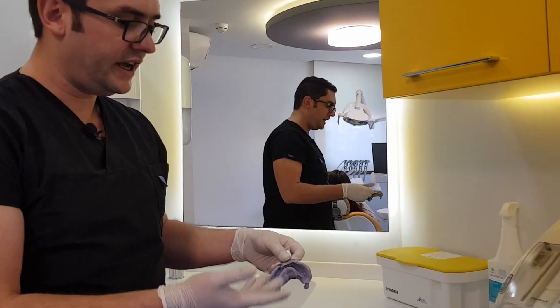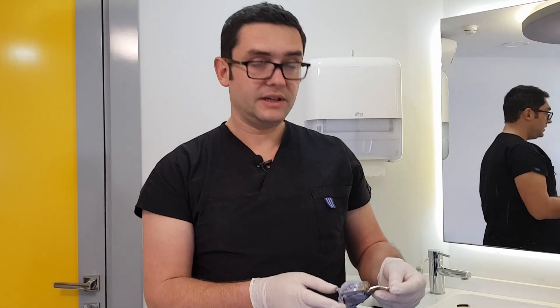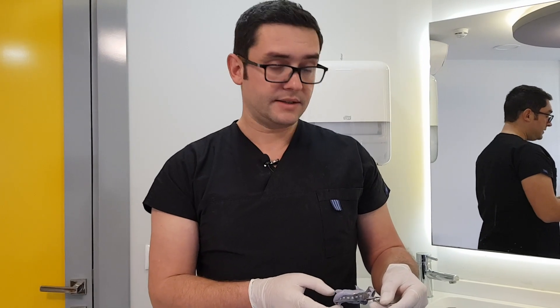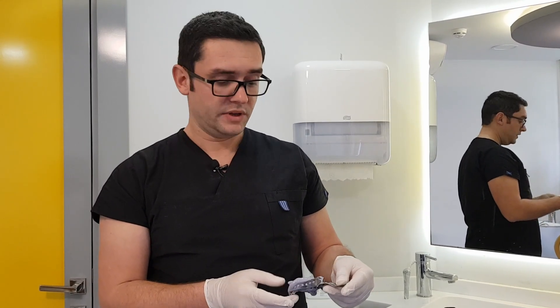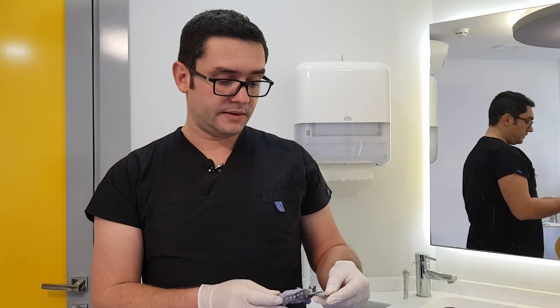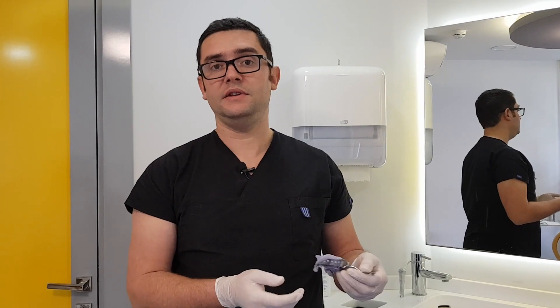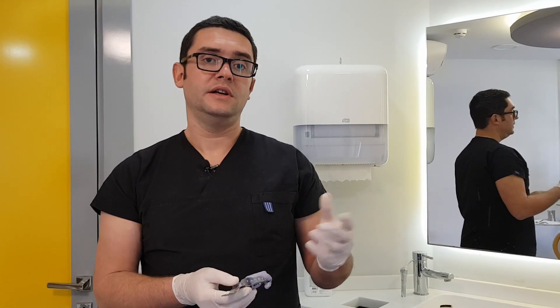Of course, if you want to create a cast model, we have to send it to the dental laboratory and they are going to create the model. These silicone materials could stand up to four or five days without changing the shape and details of the teeth. But some materials have very limited time — in 20 or 30 minutes we should create the model. If I send this veneer impression to the dental laboratory, it will arrive the next day with package delivery and they can only create a model tomorrow.